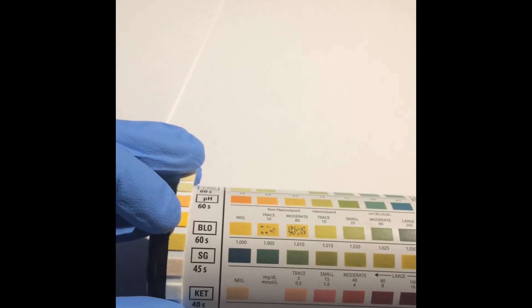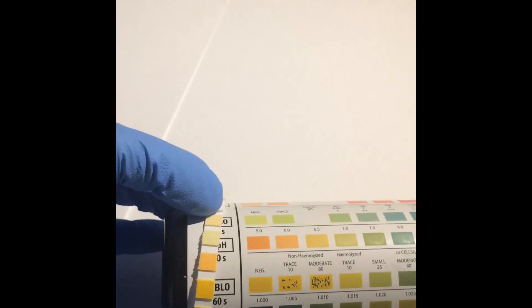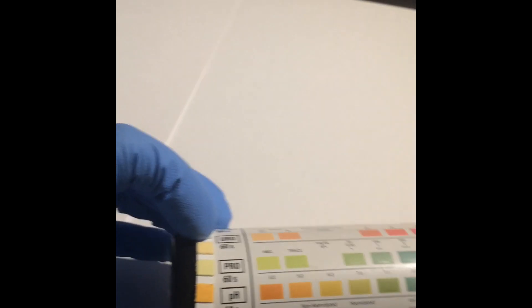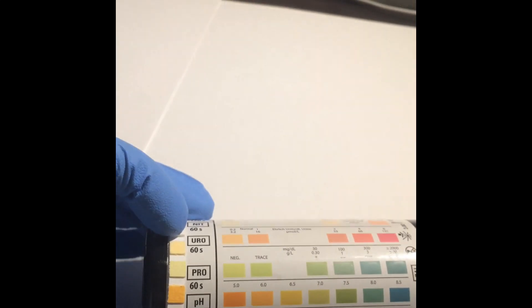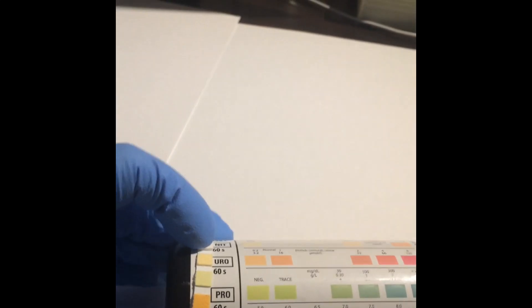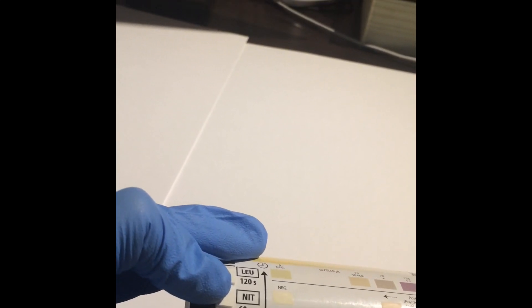Ketones at 40 seconds, specific gravity at 45 seconds, blood at 60 seconds, pH at 60 seconds, protein, urobilinogen, nitrite at 60 seconds, and leukocytes at 120 seconds.